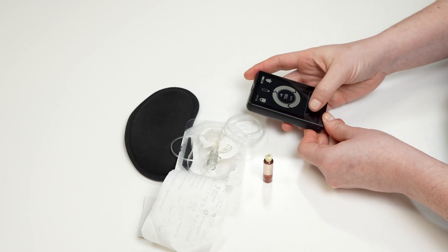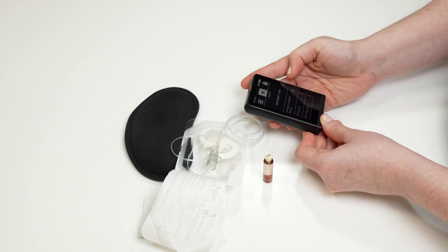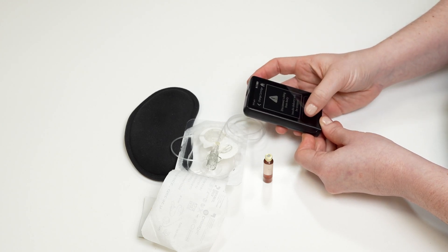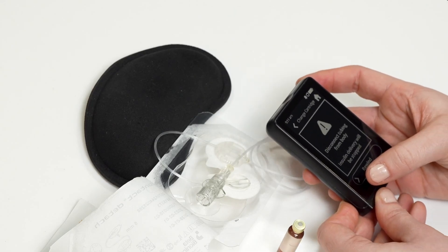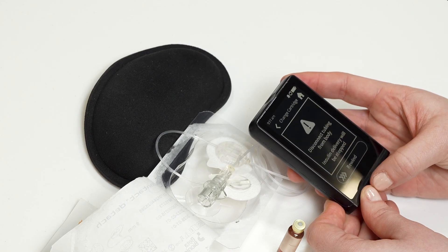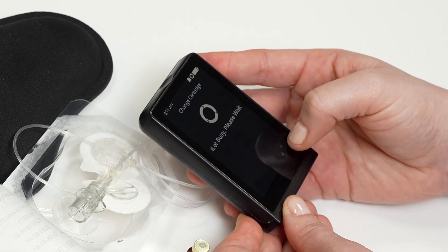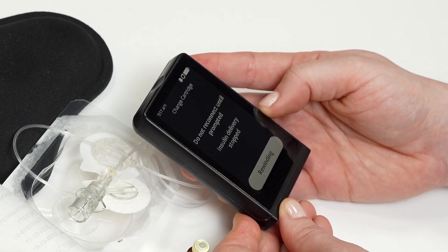Unlock your eyelet device. Tap the insulin cartridge icon on the home screen of the eyelet. Tap change cartridge and tubing. Make sure your eyelet is disconnected from your body — you should always be disconnected from your eyelet when changing your cartridge and infusion set. Swipe the rewind slider to the right. The eyelet will rewind the device to prepare for the new cartridge.